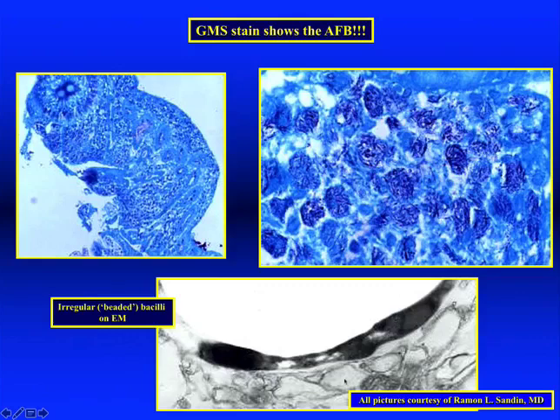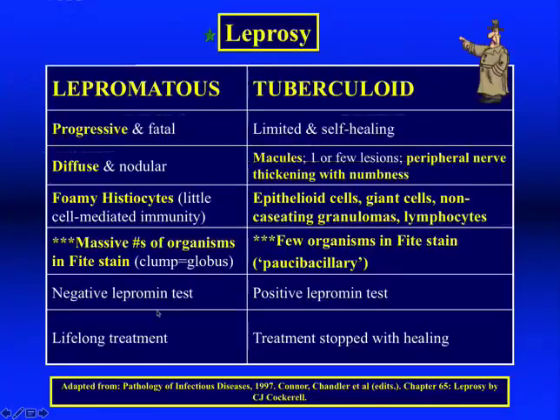And back then we used to do EM, which is great, because now we see why under light microscopy oil, Mycobacterium is beaded, because it has a huge amount of those mycolic acid vacuoles, followed by thin areas, and another vacuole, and another thin area. And that's what, at the EM level, explains why it's the beaded format at the oil light microscopy level.